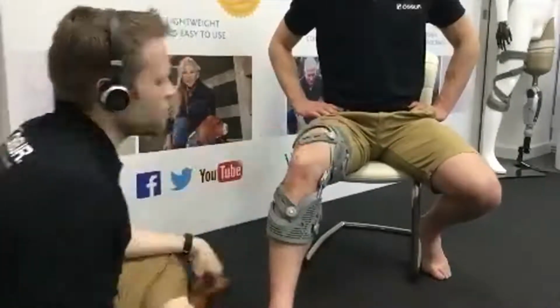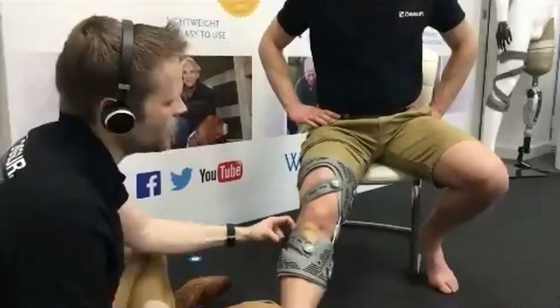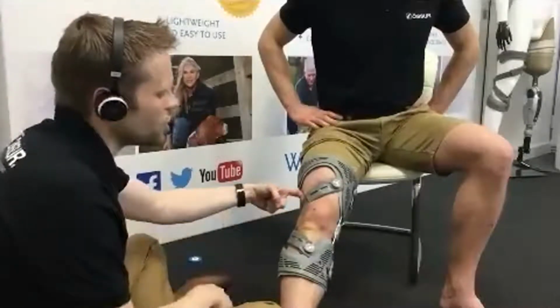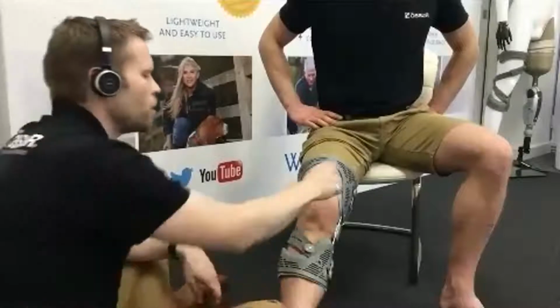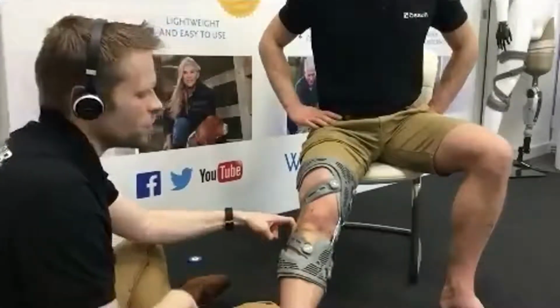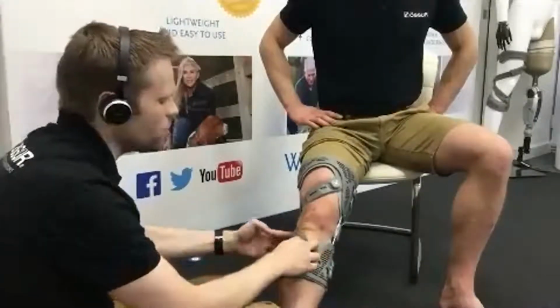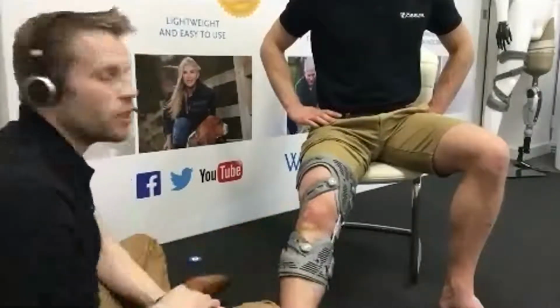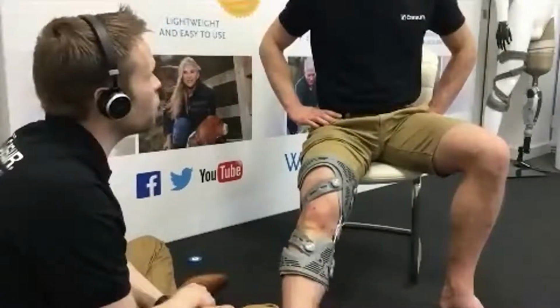And as we check the strap tension, we straighten the knee, and you can see that I can just check the tension of these straps. So ideally, what we'd want is to just about be able to get our finger underneath the strap. It's a hard thing to describe over a visual medium, but you can see we should just about be able to get those straps in tension. And I'm just going to adjust those very slightly. If you've got them too tight, you might find that the patient will say that they're not actually able to fully straighten their legs. So just be aware of that.